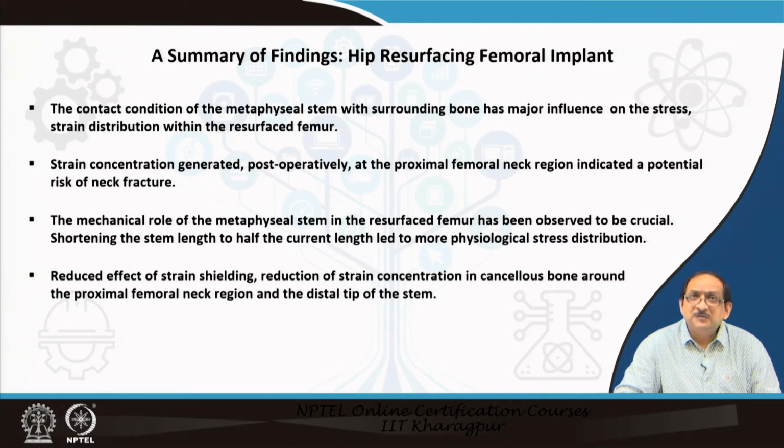Reduced effect of strain shielding, and reduction of strain concentration in the cancellous bone around the proximal femoral neck region and at the distal tip of the stem, was observed in case of the short stem implant.